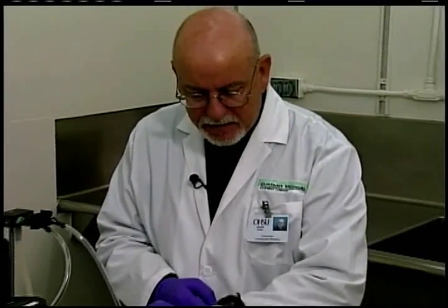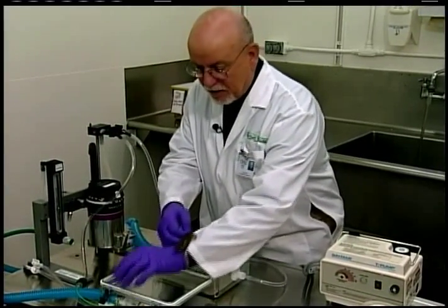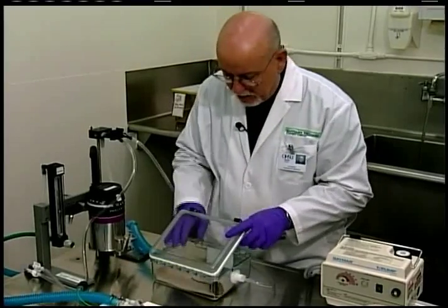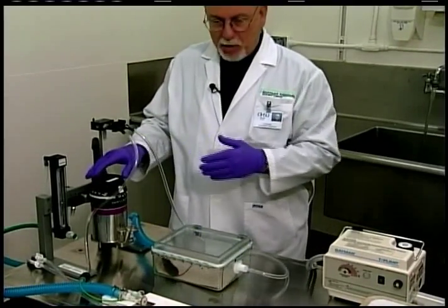Now I have our willing partner here that we're going to anesthetize, and I'll put him into the induction chamber. And remember, the induction chamber right now only has 100% oxygen in it. I'll let him just rest on the bottom right now. Close the lid down. And now that he's secure inside the induction chamber, I can start my anesthetic process.